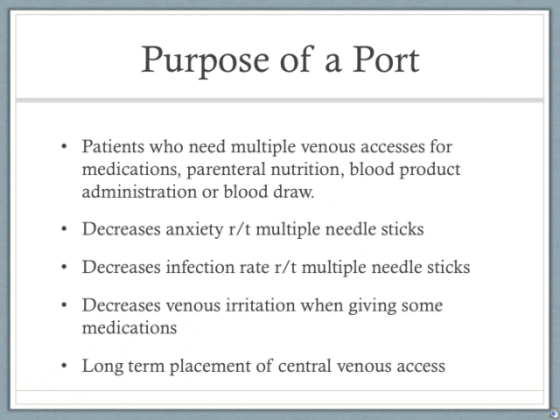Having this port decreases the anxiety related to multiple peripheral needle sticks. It also decreases the infection rate that you usually find when you have multiple peripheral needle sticks. It's also, since it goes right into a central vein, decreases venous irritation with some medications, for example, chemotherapy medications. And the main purpose really is to have long-term placement of central venous access.